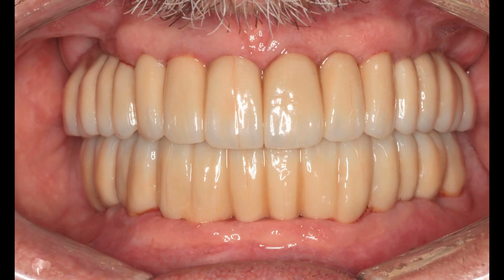Here is his final restorations. As you can see, we maintained bone and soft tissue levels beautifully, and I don't want you to get too caught up in the color here. Every patient gets to pick what color they want their final restorations, and older gentlemen usually like to have age-appropriate teeth, and other people like to have bright white. It doesn't matter to us, so if you think these are a little bit too characterized, no problem. This is just what his preference was.